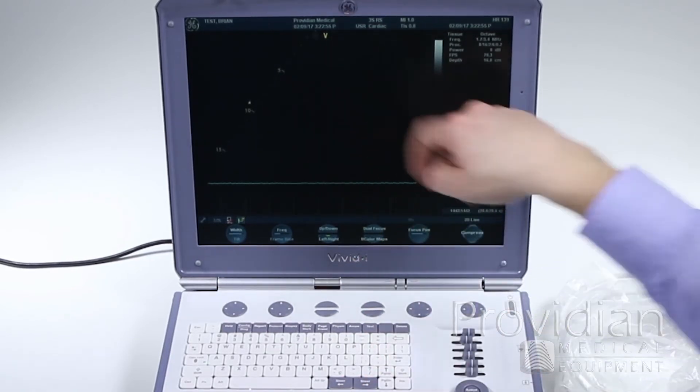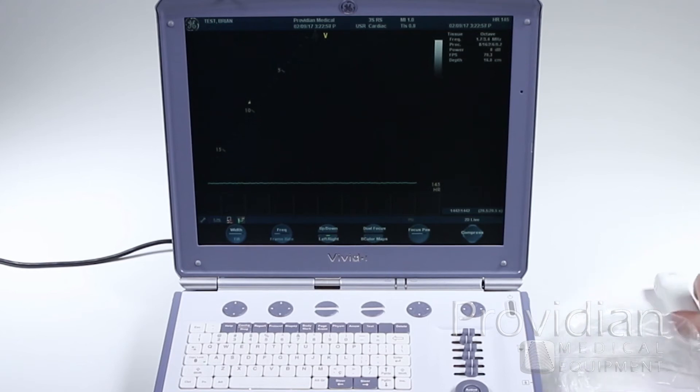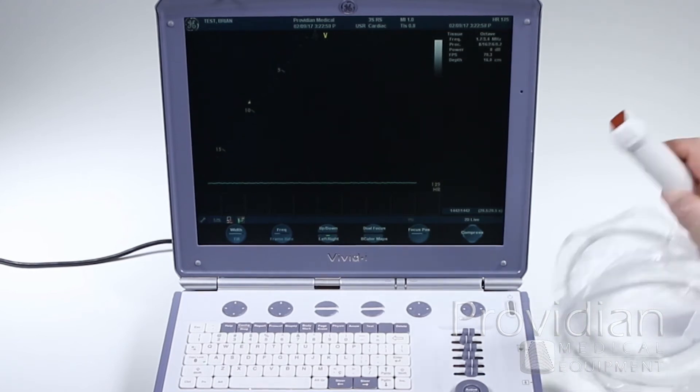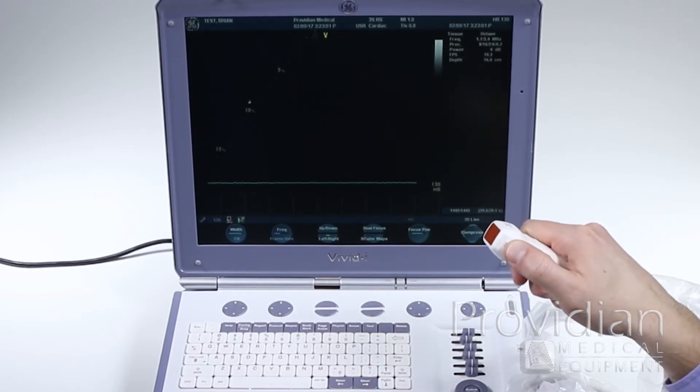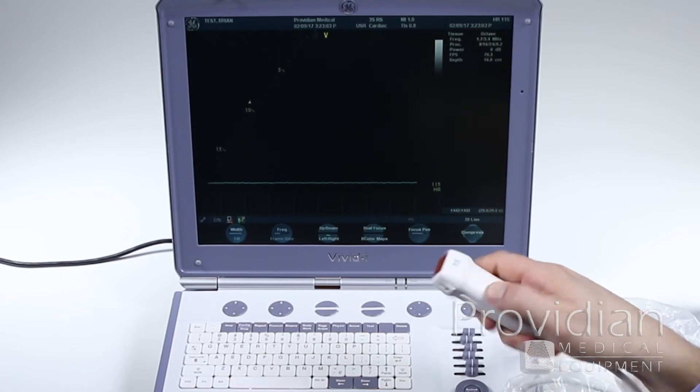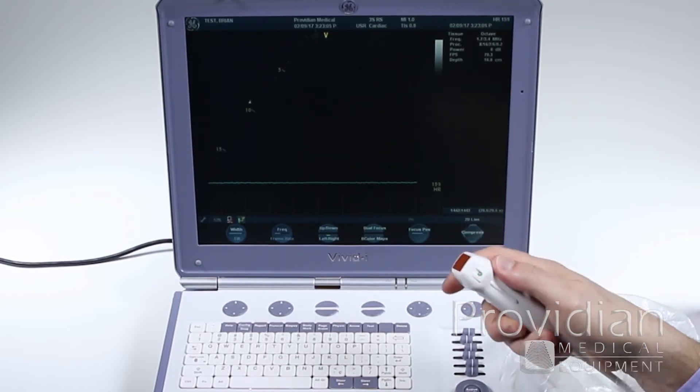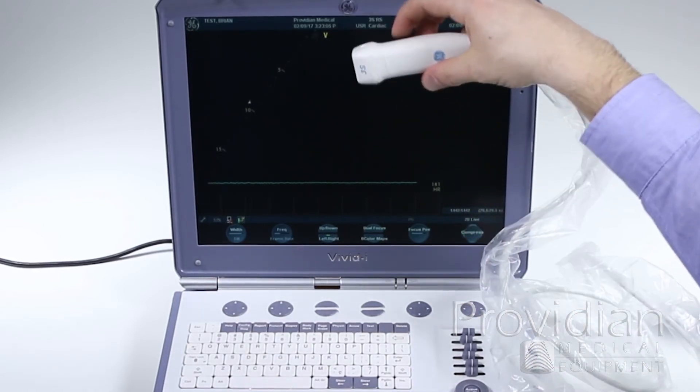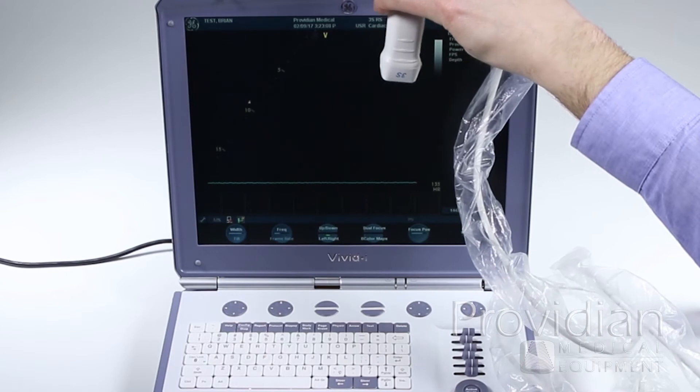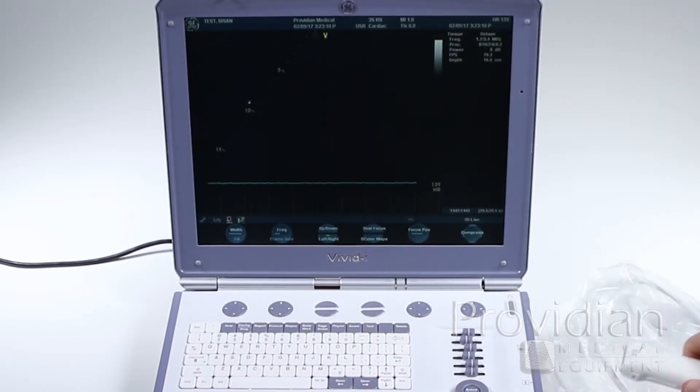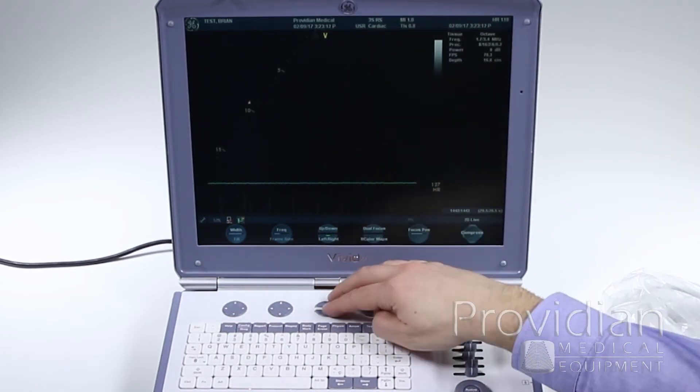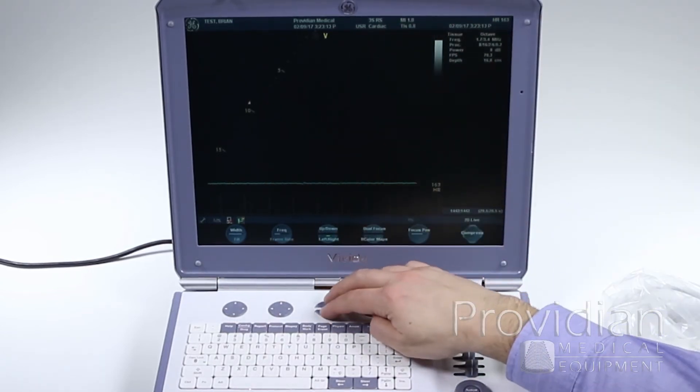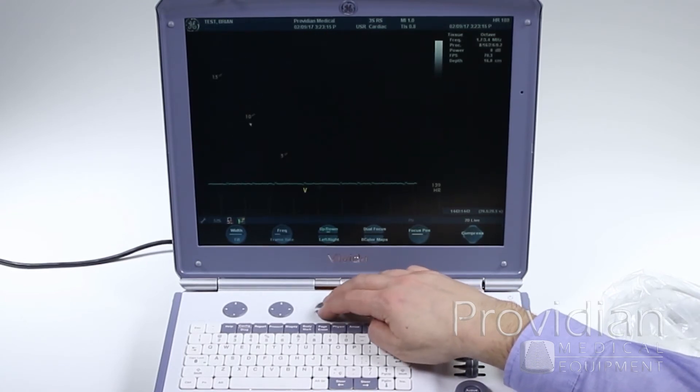So on the imaging screen, we have this V, which is the probe orientation marker that relates to this little green dot right here. Your probe may show something different, but the other probe does not have one. This green dot is showing that that's how the probe is going to be. You can switch that by hitting left, right, up, down. You can change the view that way.